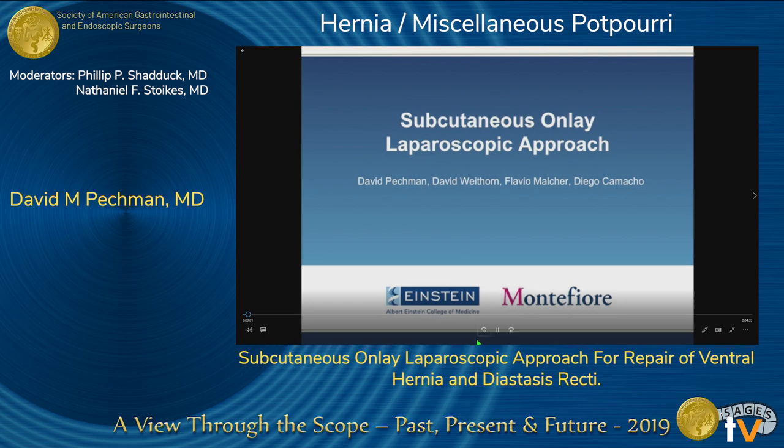In this video, we will show a subcutaneous onlay laparoscopic approach to a ventral hernia repair and repair of diastasis recti. The patient is a 37-year-old woman who presents with an umbilical and ventral hernia as well as a diastasis of the rectus muscle.